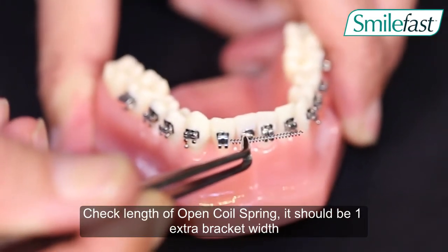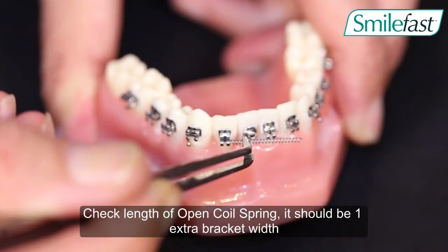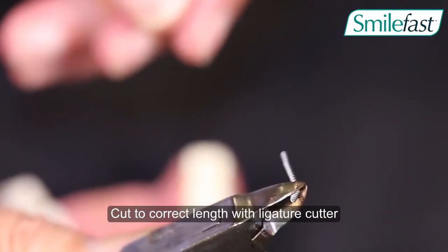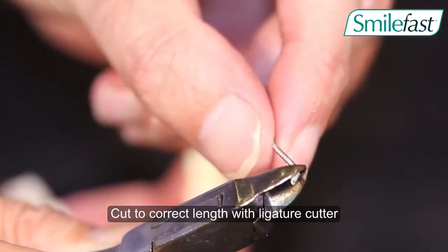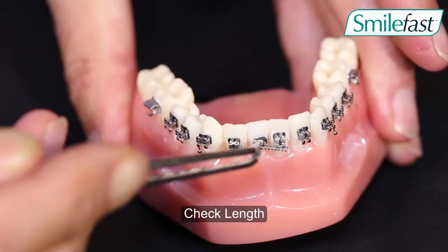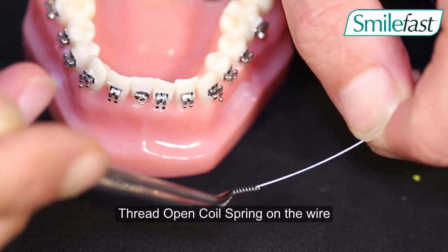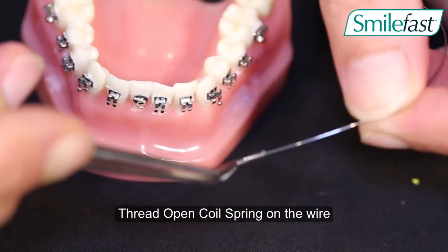Whenever we want to gain space, we utilise an open coil spring. We measure the distance from the mesial of one bracket to the mesial of the adjacent bracket. The spring will be activated by one bracket width.